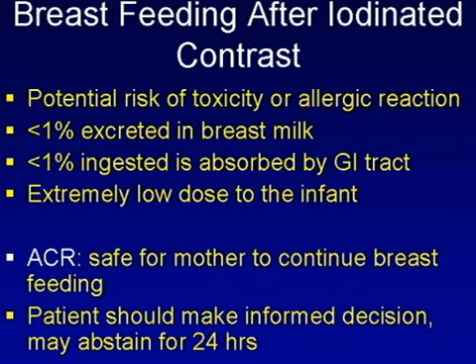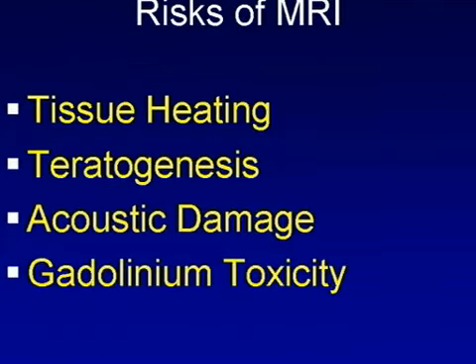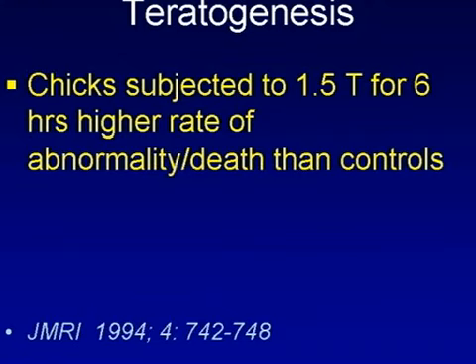So the ACR states that it is safe for the mother to continue breastfeeding after receiving iodinated contrast, but they do say that you should explain the issue to the patient, and you should allow her to make an informed decision, and she may decide to abstain for 24 hours. Leaving CT now, let's go on to MRI. This has a sort of different set of issues regarding safety. These have to do with tissue heating, also teratogenesis, acoustic damage, and then gadolinium toxicity.